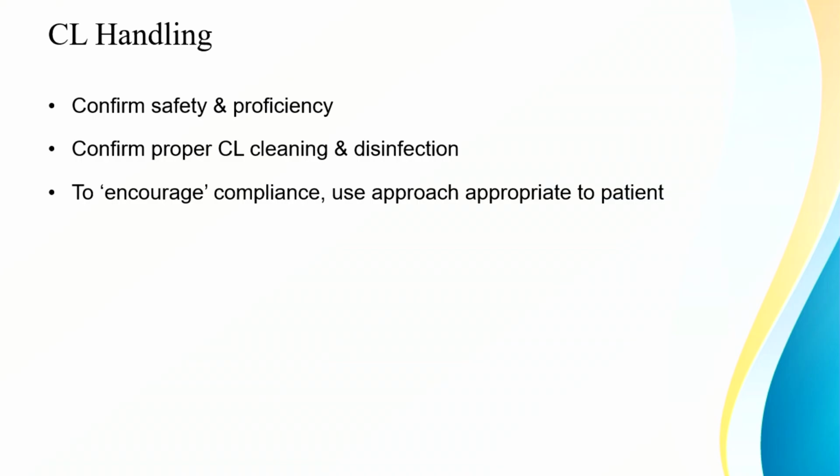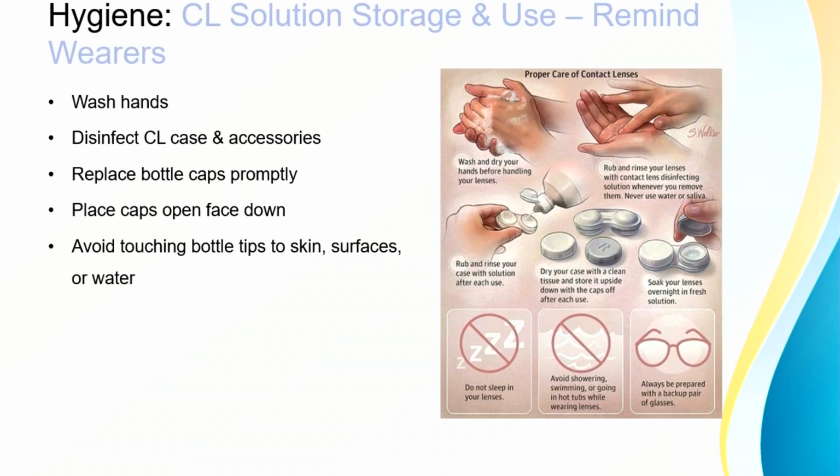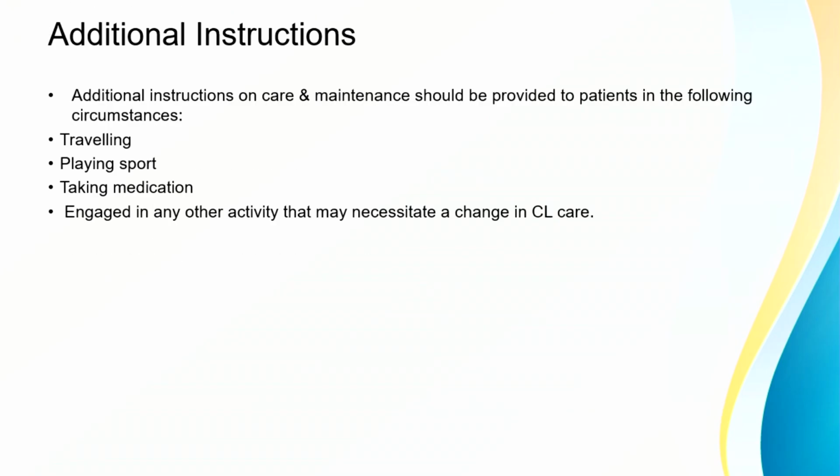If the patient comes to your clinic with the contact lens on the eye, ask the patient to remove and clean the lens in front of you and watch how they are doing it. Because of that also, you can face a few issues later. So again, care and solution: these are a few brochures which tell about the storage, and other details like replacing the bottle caps, not to tip the bottle cap, or not to touch the bottle cap, like how we do with eye drops. All these are very important points which we have to reiterate to every patient.